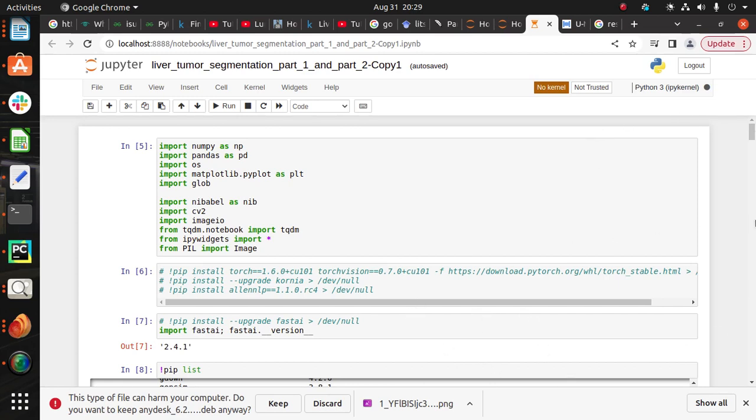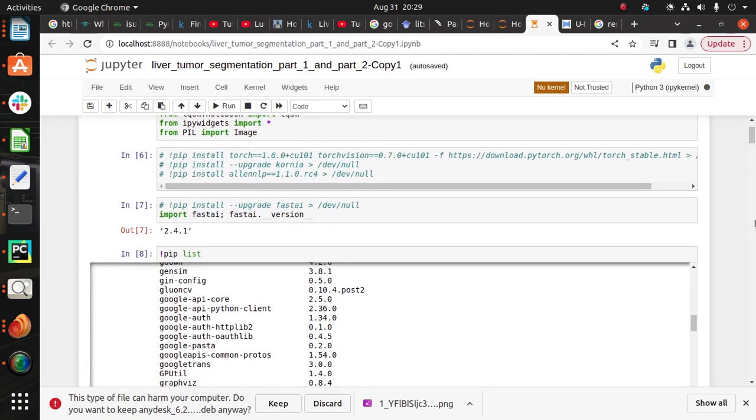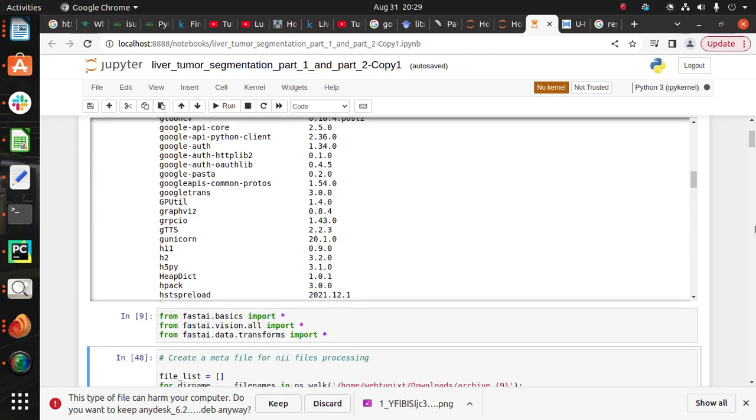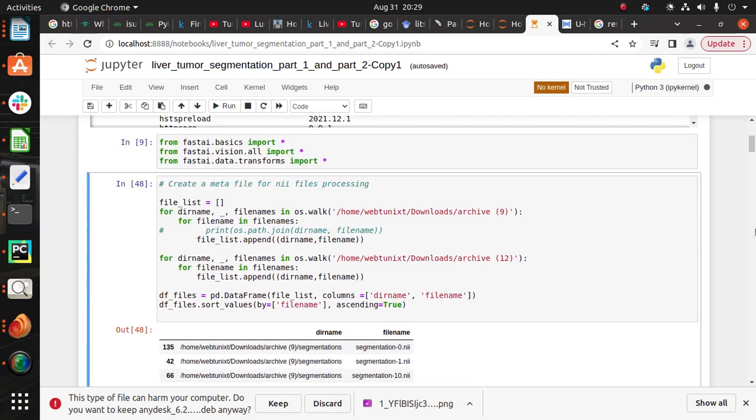After that, create a meta file for the NII file preprocessing. A meta file is a text file that contains the name of the image files. So in the notebook you can see the segmentation and the volume dot NII files.